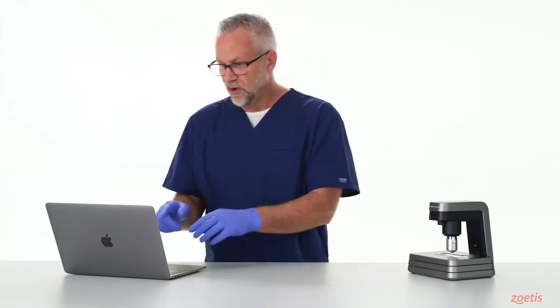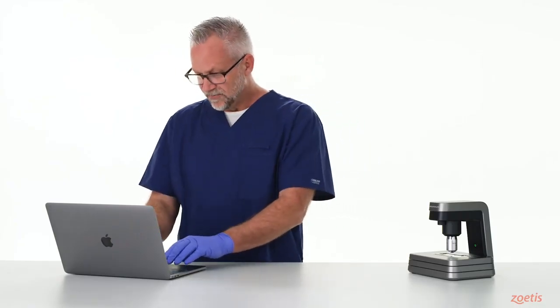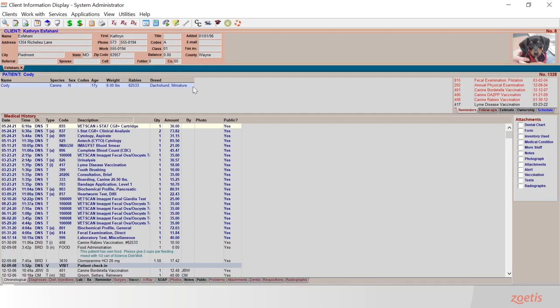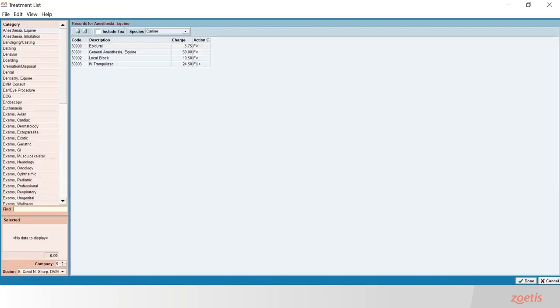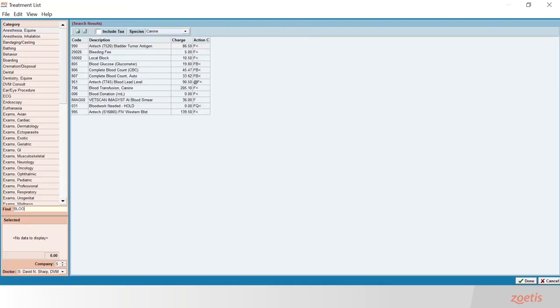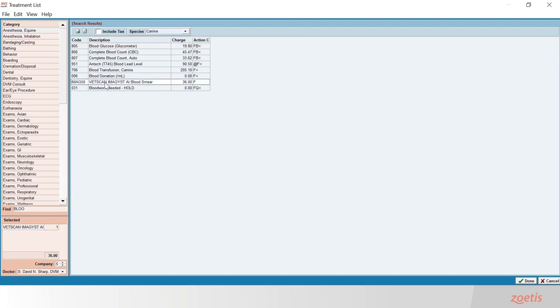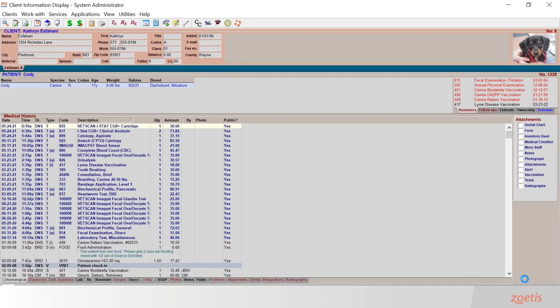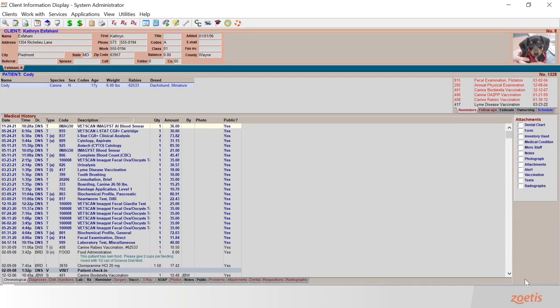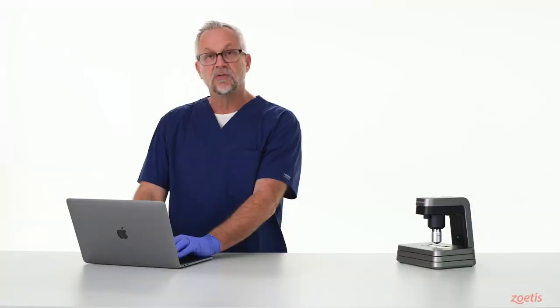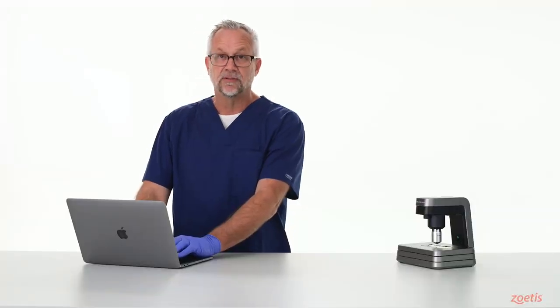Next, we're going to move over to our practice information management software, then locate the animal's chart and record for whom we're going to run a test following an abnormal CBC result. In this case, we're going to enter the treatment code for AI BloodSmear for a test for Cody, a dog with a patient ID of 1328.